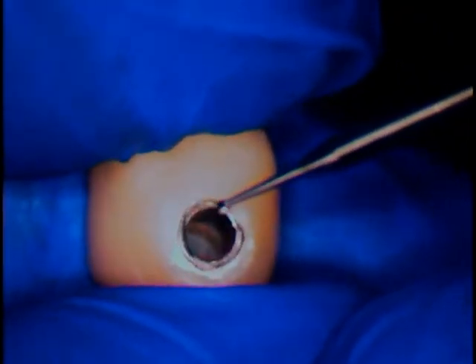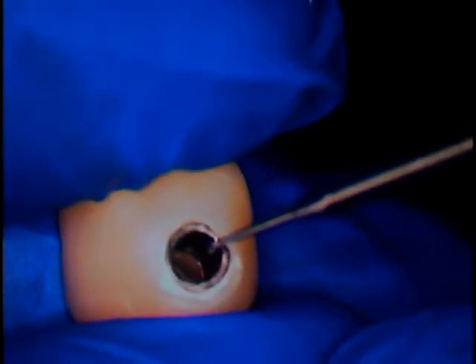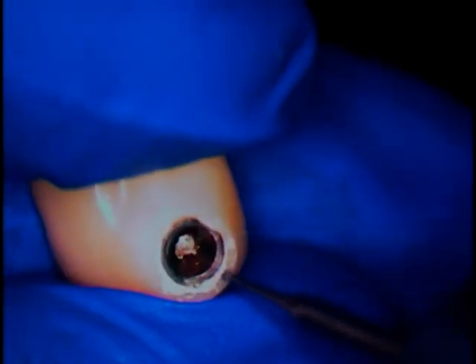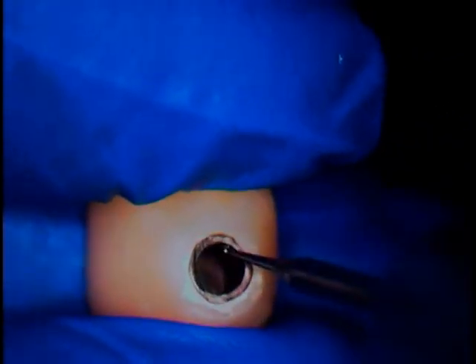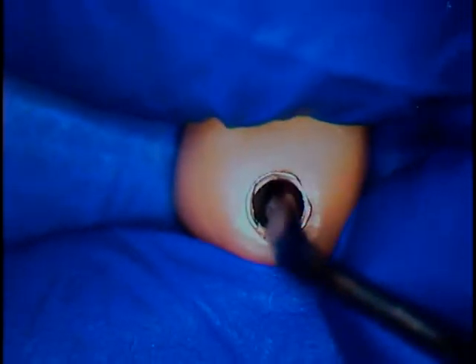The burr we're going to use is a quarter round. Look at the diameter of this burr — it's going to be almost the exact diameter of the fractured component. So it's not much you're drilling. You're just going in, scoring first, then drilling through, then going to the other side and fitting an instrument — a Hollenbeck instrument. We might even pick a larger Hollenbeck when that time comes. The diameter is key.